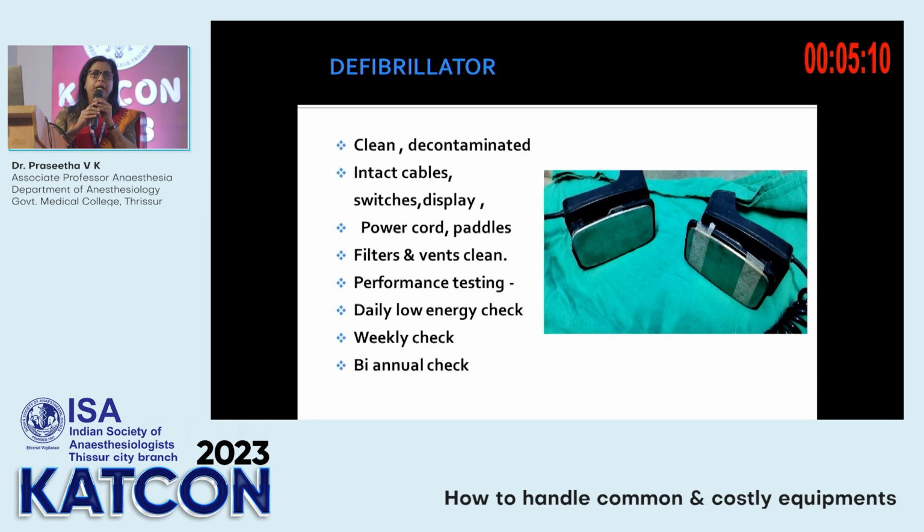Next is a defibrillator, very precious equipment and a life-saving one, especially in a situation of cardiac arrest. So keep the defibrillator always clean and decontaminated because you are using it for a multitude of situations. Sometimes you may use it for a trauma patient, sometimes for an elective procedure. So there is every chance that it may be contaminated. So keep it decontaminated after every use.